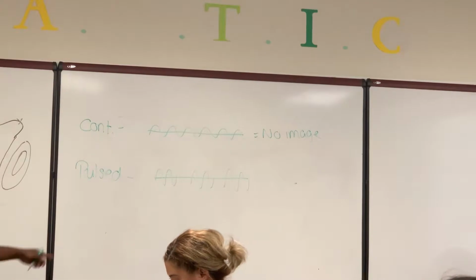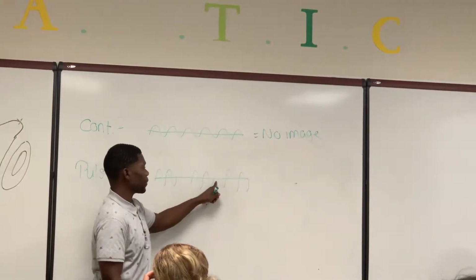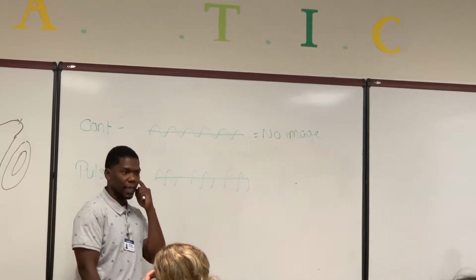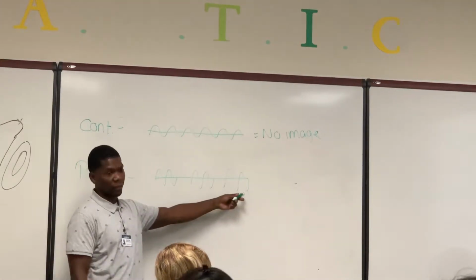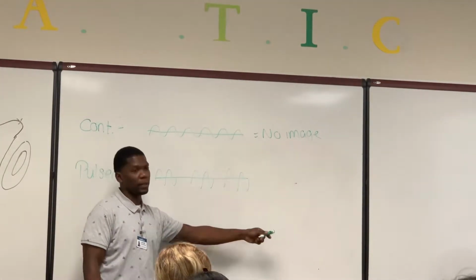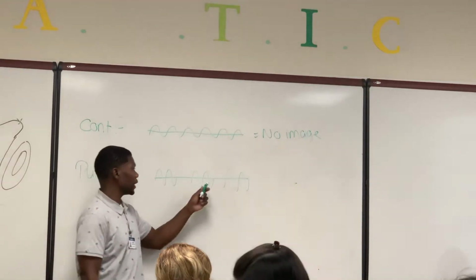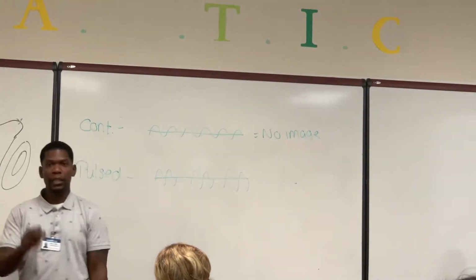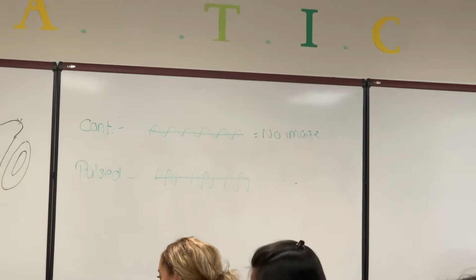You see with pulse wave, we have these gaps right here, right? These gaps in time are actually the listening time of the transducer. So say this is the first pulse. It's going to send this pulse out first, then it's going to listen for those returning echoes. Because remember, we know how ultrasound works: it sends out sound waves, it hits the media, then it bounces back to the transducer.